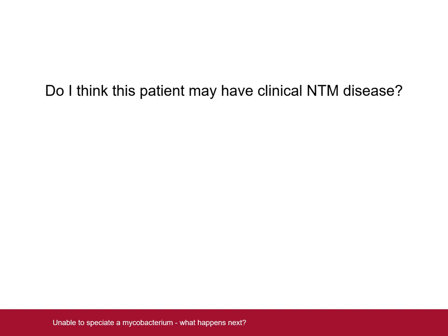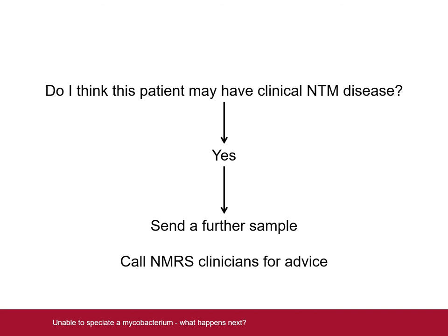If the answer is no, then no further action is needed. If the answer is yes, we recommend that further samples are taken from the patient. Even if speciation is also not possible on the second sample, having two sets of sequencing data can often allow the NTM present to be identified to at least a broad group level. NMRS clinicians are always happy to discuss such cases, as we may be able to offer more guidance in the context of more clinical information.